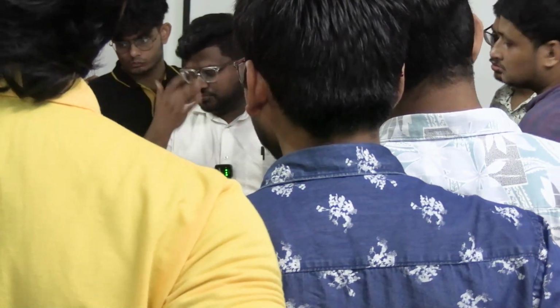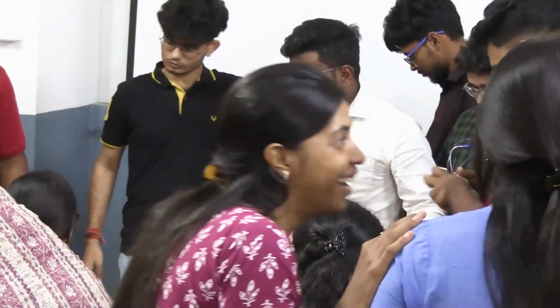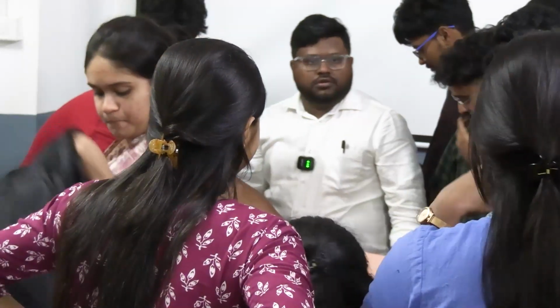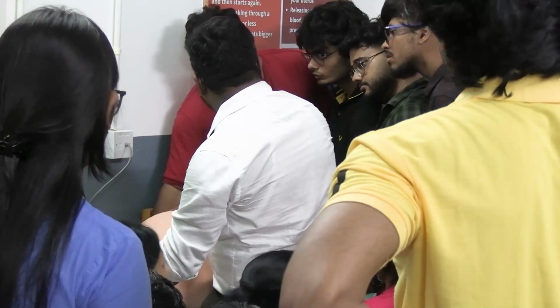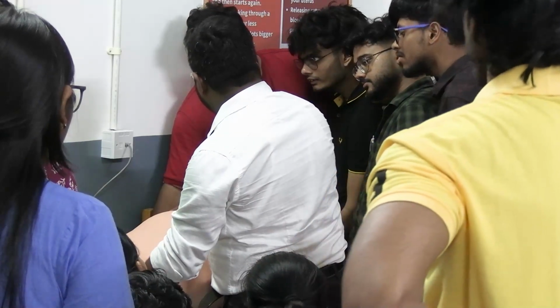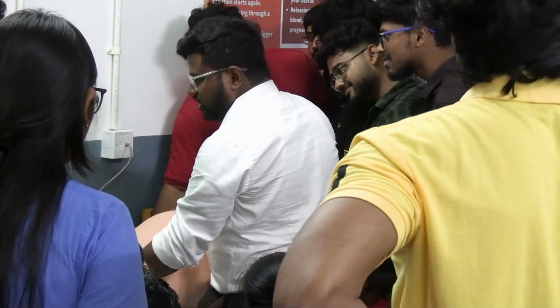তোকে তো দেখাতে হবে, ডপলার দিয়ে দেখাতে হবে। সেটা এনেছিস কেউ? সেটা দাও। এটাকে ওই প্লাগ পয়েন্টে লাগা, এটাকে ধরে ওই টেবিলে রাখ, প্লাগ পয়েন্টে লাগা। দাঁড়া একটু দাঁড়া, টেক দিস। আচ্ছা, তারটাকে লাগিয়ে দে। এটা কিন্তু ব্র্যাডিকার্ডিয়া হয়ে গেল, ফিটাল ব্র্যাডিকার্ডিয়া হয়ে গেল এত কমে, ঠিক আছে? দিস ইজ ট্যাকিকার্ডিয়া, দিস ইজ সামওয়্যার ইন দ্য নর্মাল রেঞ্জ, ঠিক আছে?